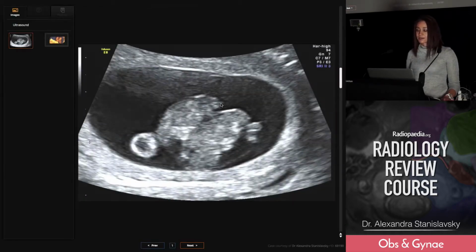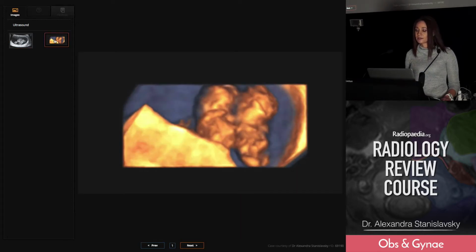This, on the other hand, we've got two babies that are very closely together, located in a single amniotic sac, which hopefully are projecting fairly well there, the amnion. There's only one yolk sac associated with this. So really, this is a straightforward monochorionic monoamniotic pregnancy, and the only issue in this case was trying to demonstrate that these babies were not actually conjoined twins, which they weren't.